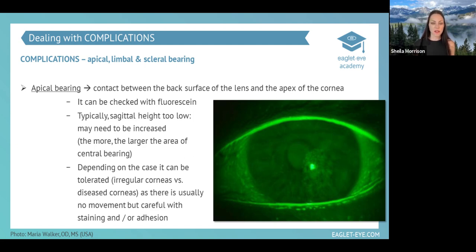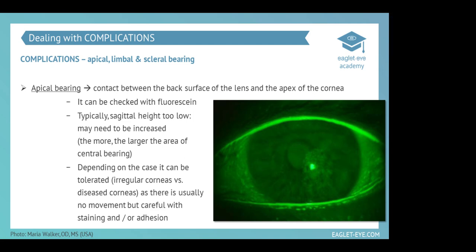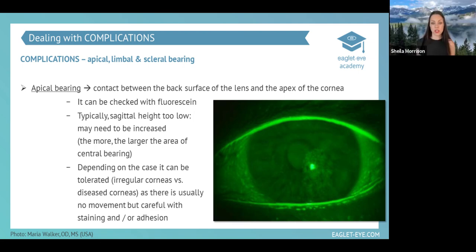Usually the apex of an eye with keratoconus is somewhere near the visual axis. And that's actually what can create the biggest issue for us when trying to give good vision to a patient with keratoconus: scarring. Anytime that we have a lens that touches the cornea where we have nerves and are sensitive, we can also create discomfort, and patients will find that the lens is not comfortable and they can't wear it.